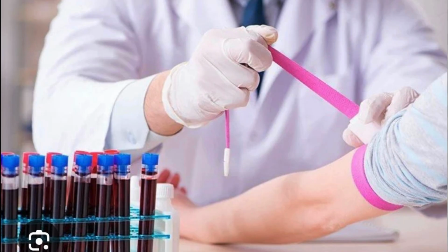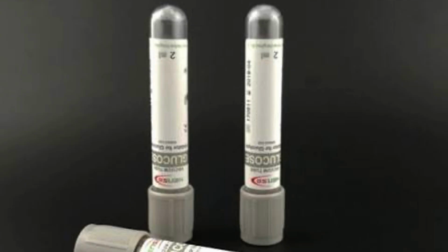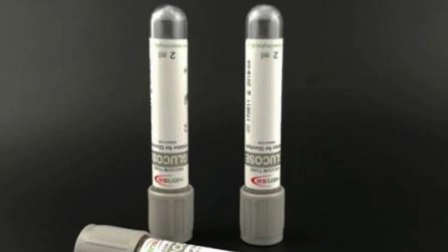Some of the common tests that you will see for the gray top tube are fasting blood tests. You'll probably see the abbreviations, so I'm going to give you both. You have fasting blood glucose, which is FBG, the oral glucose tolerance test, which is OGTT, and blood alcohol concentration, which is BAC.